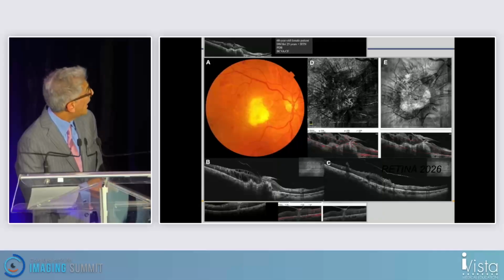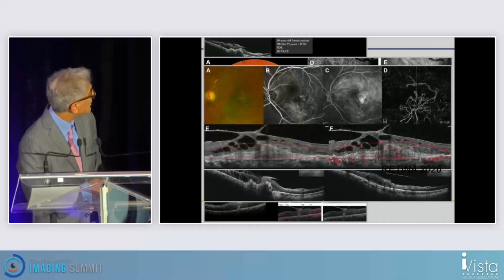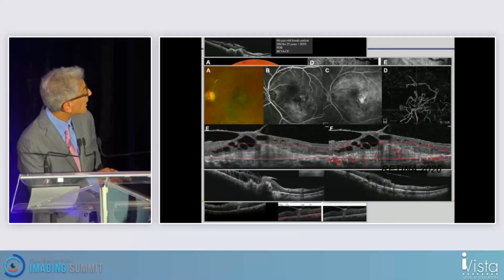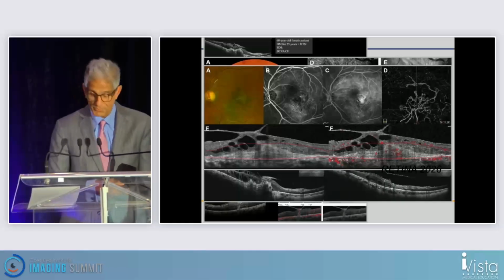It should be released in the next few days. And you can see the area of flow going all the way from the choroid, the subretinal, intraretinal, and then into the cortical space via this central area of posterior hyaloid fibrosis. And another case illustrating the classic phenotype with identification of the neovascularization at all 4 levels.